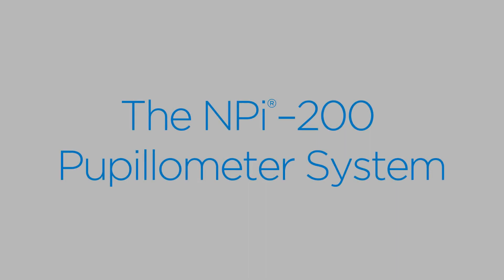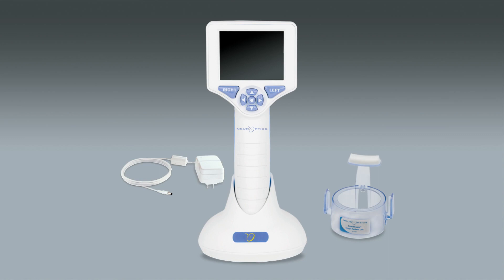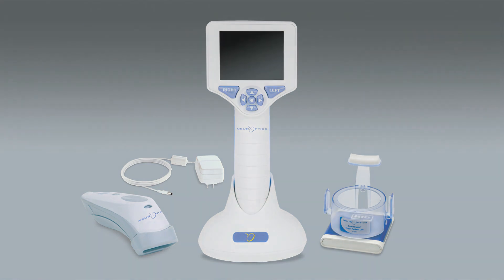The NPI 200 pupilometer system consists of the pupilometer, the charging station, a power supply, and the smart guard. Optional components include the barcode scanner and the smart guard reader, required when the pupilometer data is integrated into the patient's electronic medical record.